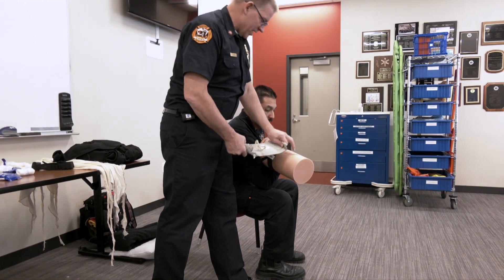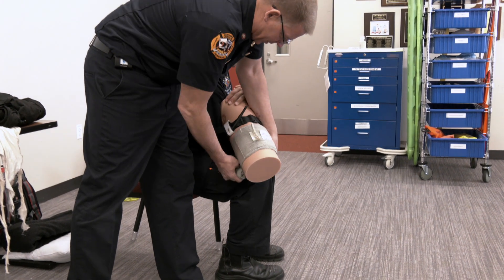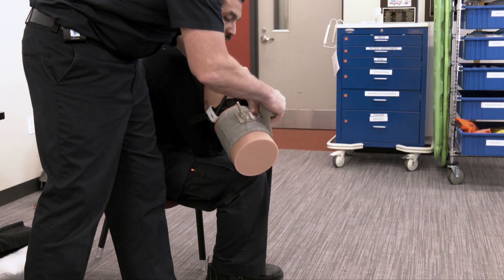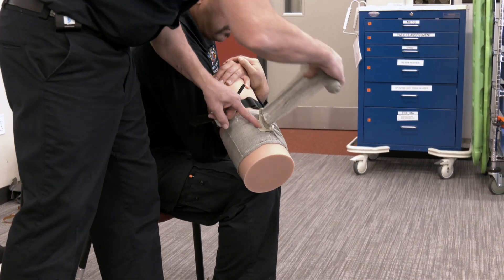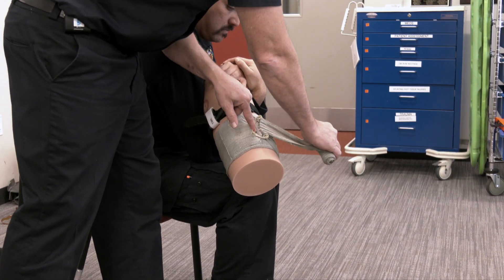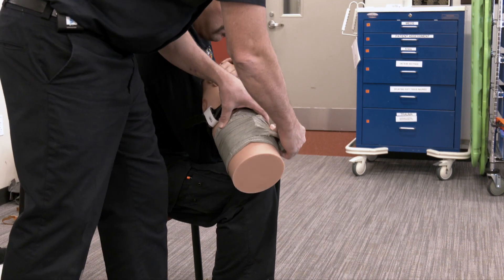You have the padding right here. We're going to put this on and bring it around. We go through this little bar — by going through it and pulling back, what you're doing is creating direct pressure on that area — and then you wrap it nice and snug.